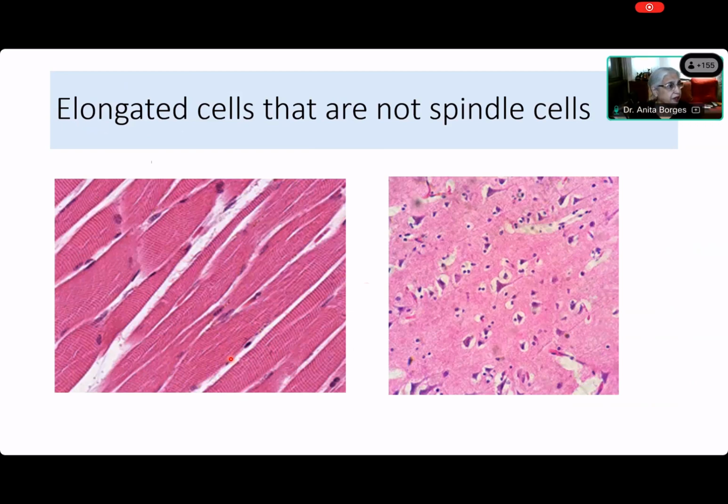All right, Shashank is taking time. Kedar, which is that other muscle cell? Smooth muscle, ma'am. Smooth muscle cell, yes, because the smooth muscle cell is an elongated cell and it does have a spindle nucleus, and that spindle nucleus is sitting inside the cytoplasm and not at the periphery of that cytoplasm.